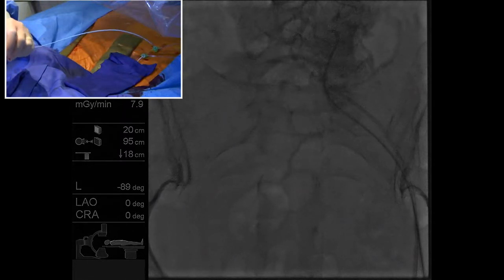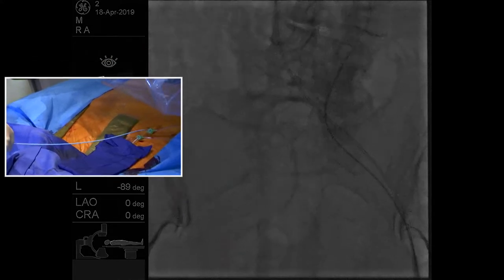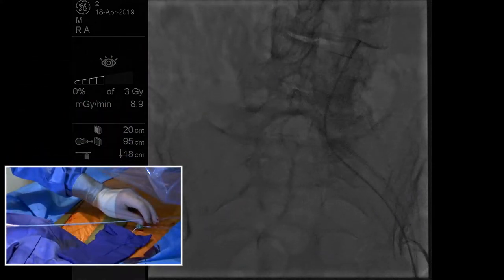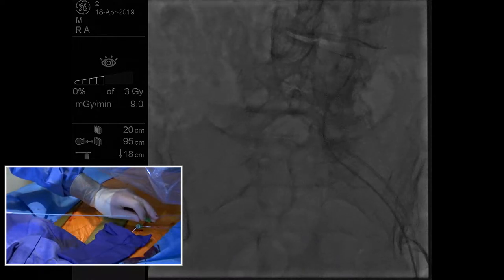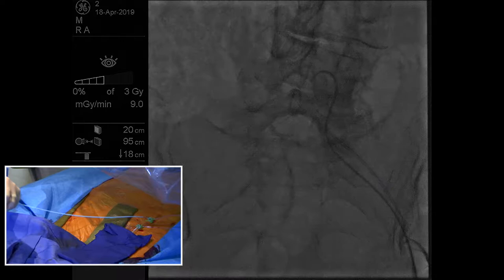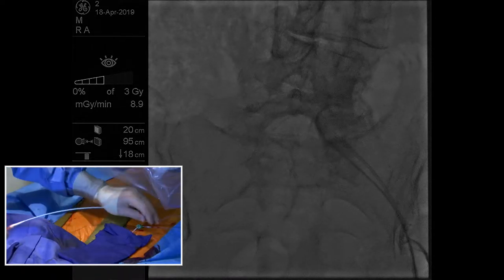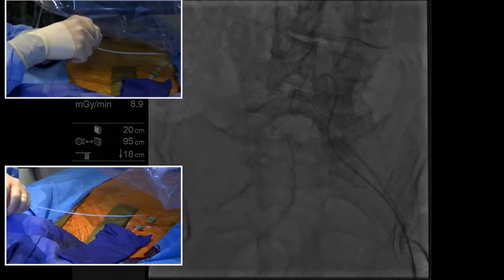Looks like there's some calcium there too, isn't there? There it goes. So it's pretty high up actually, so we're gonna have to go a little higher. Get this to hook. There we go. Sitting again in the plaque here. Come on. There we go. That's much better.